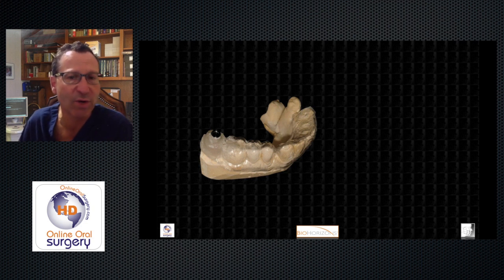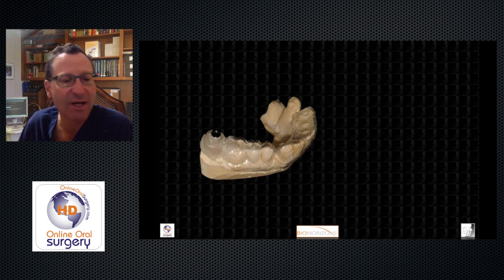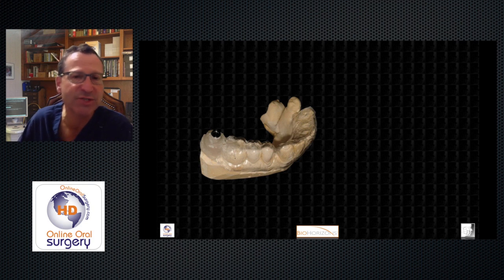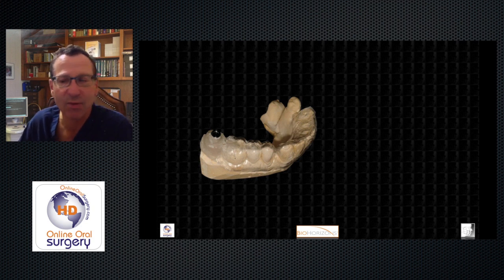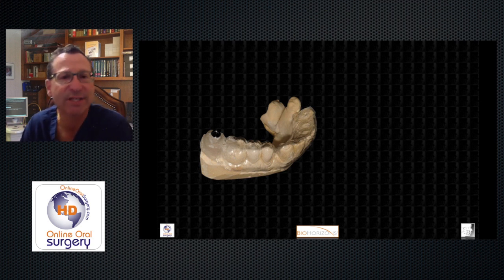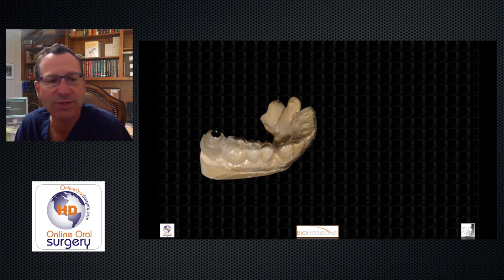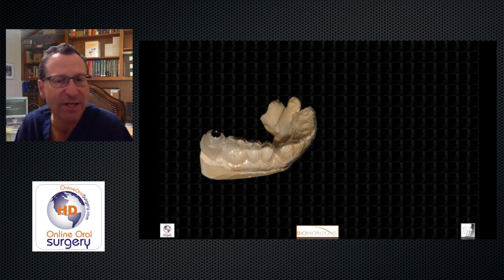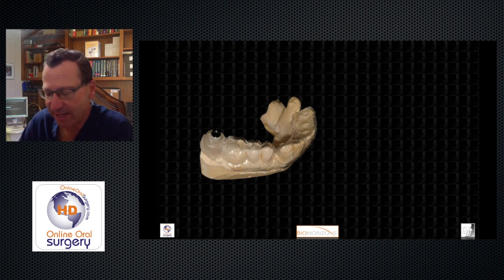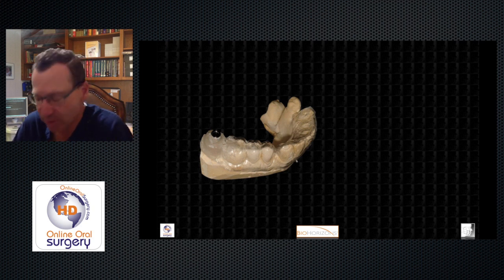Here's a case where I used a surgical guide. This patient came in — pre-cone-beam in my office — and we took out tooth number 31. I wanted to make sure the implant was properly placed because I knew the distal root of number 30 went kind of distally. So I made a surgical guide with a metal sleeve to make sure my pilot drill was in just the right place at the right angulation, and all subsequent drills would follow that path so I wouldn't come close to tooth number 30.